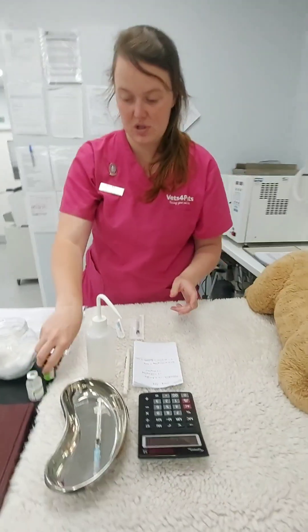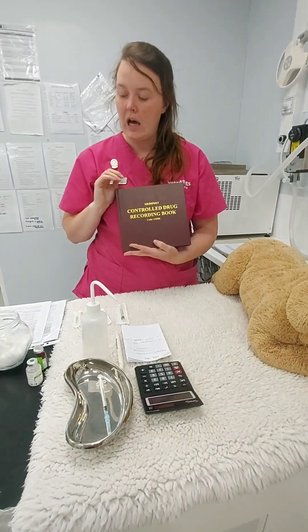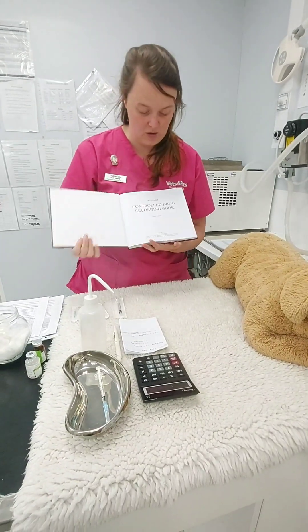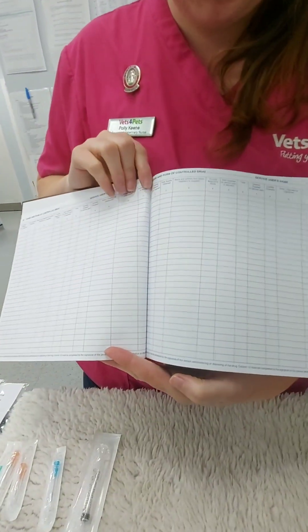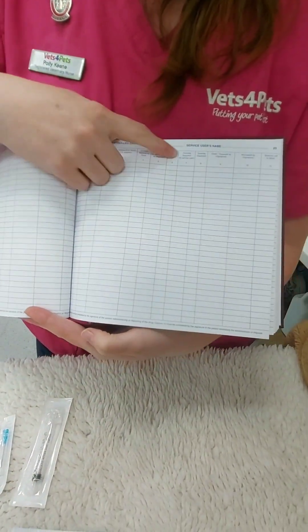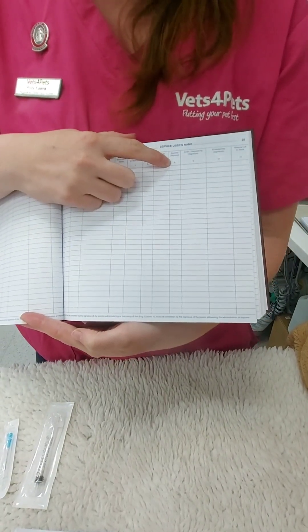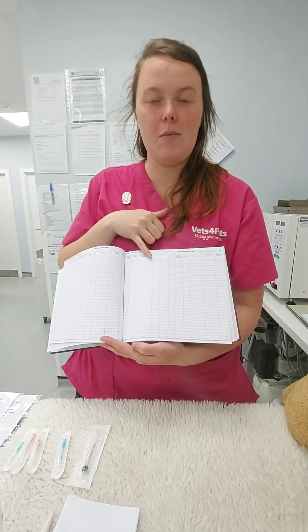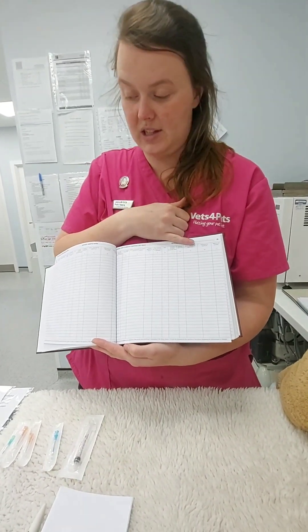I don't have artery forceps so I'm using the lid. Needle off, syringe in pharmaceutical waste, waste in domestic waste. The final step is to note everything in your control book. You'll likely have a printout form with the relevant columns: patient name, time of day, quantity disposed of — so 0.5 or 0.1 — and your signature. You'll also have the date, patient details, quantity given, wastage, and a signature point.